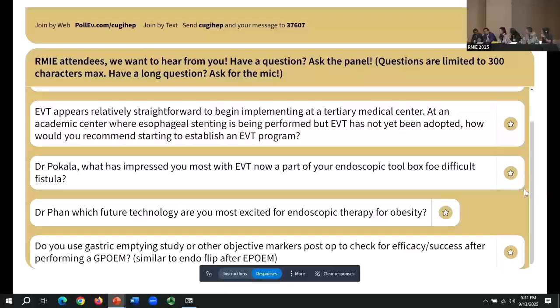What is your preferred stent when you use a fully covered duodenal stent? Because we've had patients referred to us who have been sutured and have had fully covered stents placed that have migrated. I know. So what's your preference in terms of the type of stent? Because I feel like the through-the-scope stents, even though they're so easy to place, have less radial force, so they're actually at higher risk of migration even with suturing.